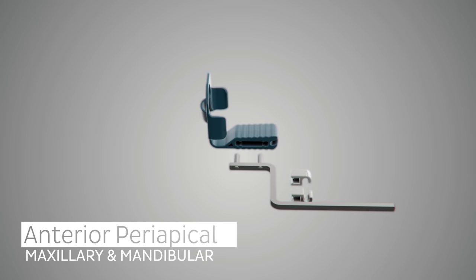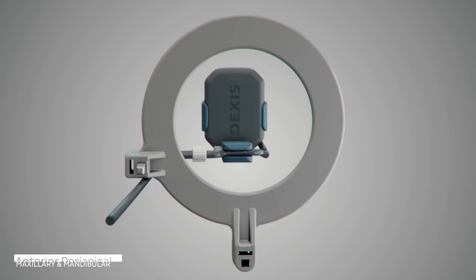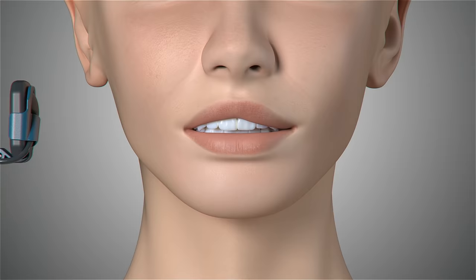We will now move on to capture anterior periapical images. For anterior periapical images, you will use the same aiming bar and ring configuration. However, you will switch the yellow posterior bite block to the blue anterior bite block.